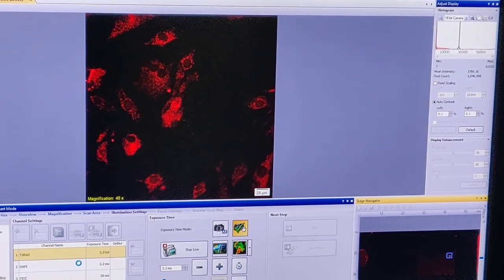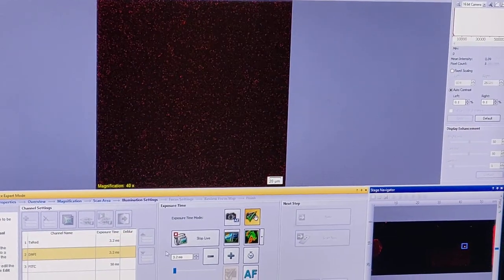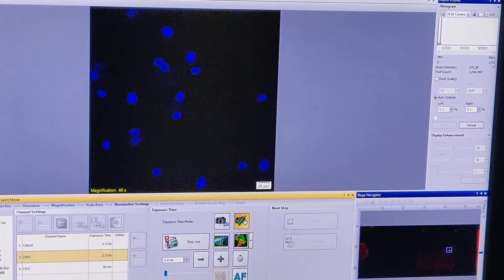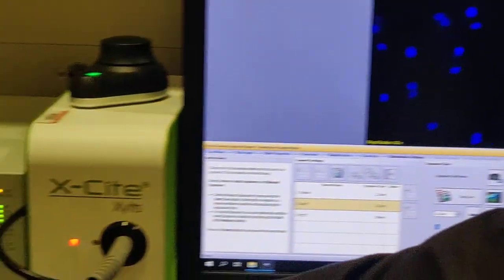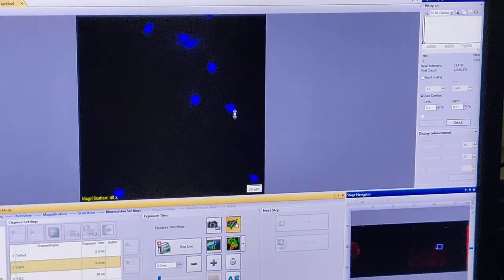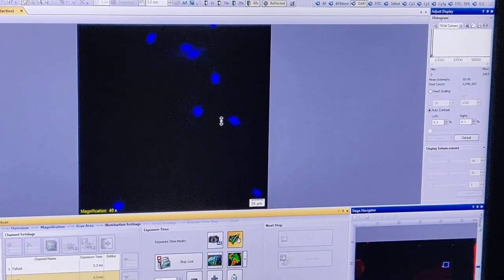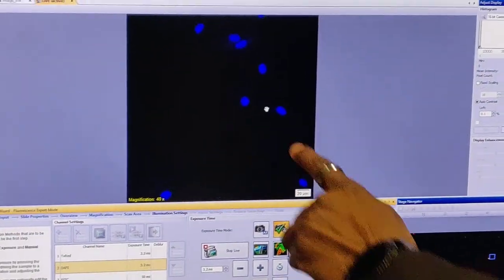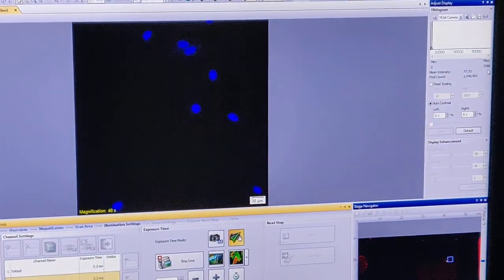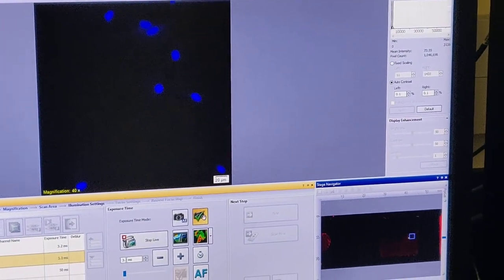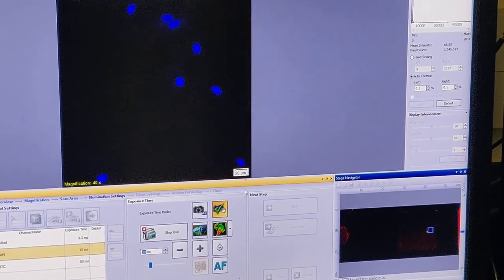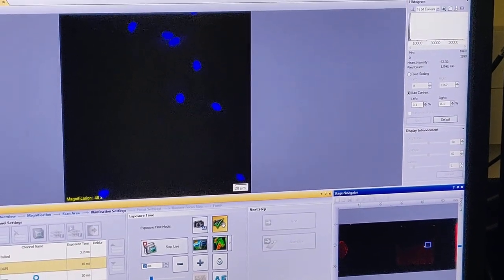If I switch to a different color like DAPI at 3.2 milliseconds, I'm getting 6000 units — pretty good for a focusing channel since I only care that it's detectable as dots, not its texture or shape. But if you really want more signal, you can increase exposure to 10, 20, or 50 milliseconds depending on the need. At 20 milliseconds DAPI gives 18,000 units. I move around to check consistency.